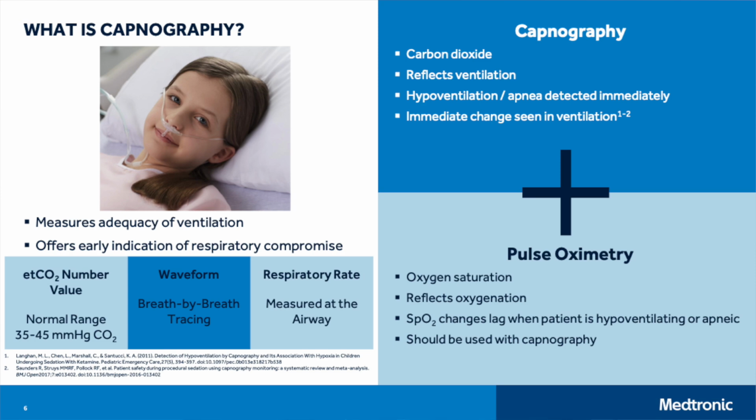The actual number is going to vary depending on whether my patient has COPD, pneumonia, or a history of COVID, and that's going to adjust what their standard CO2 reading is. So we need to consider that when we're considering a standard value and a variation of that number.